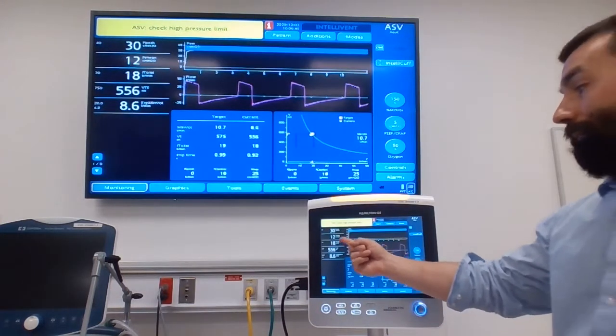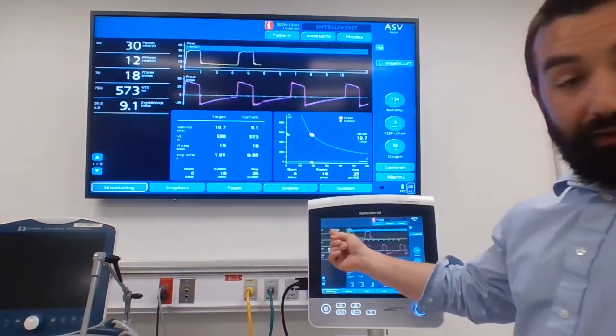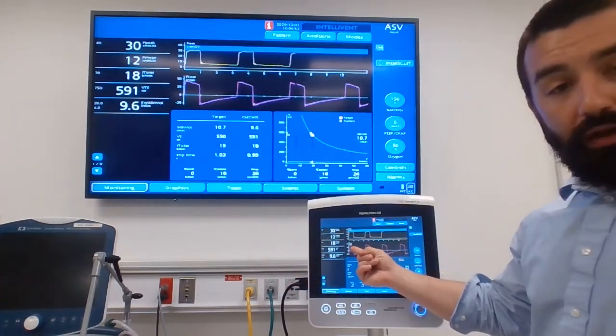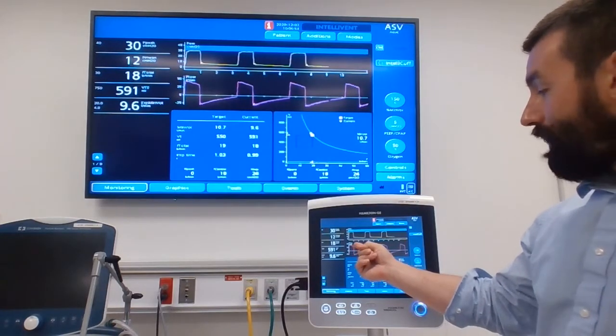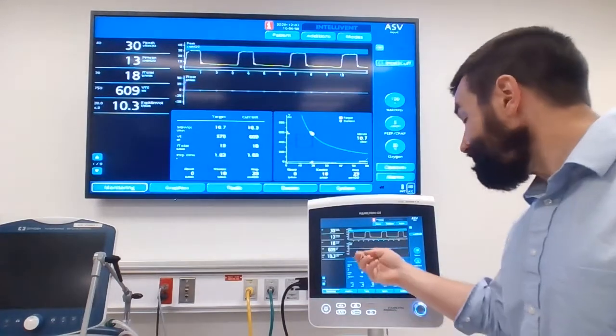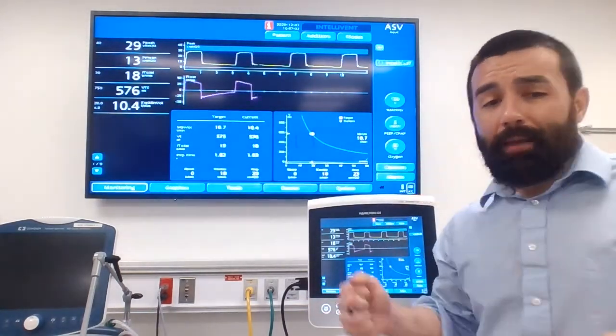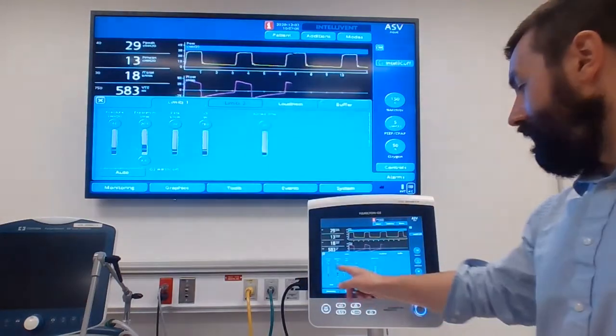All right. Typically, since we're delivering volume targeted pressure ventilation in this, I would be leery about going any higher than 30. But if we look at my particular patient's flow waveform, that breath cycles off far before it gets to the point of reaching zero flow. So we know there isn't total equilibration between my Y and my lung. So I could go up on this a little bit with some caution here.